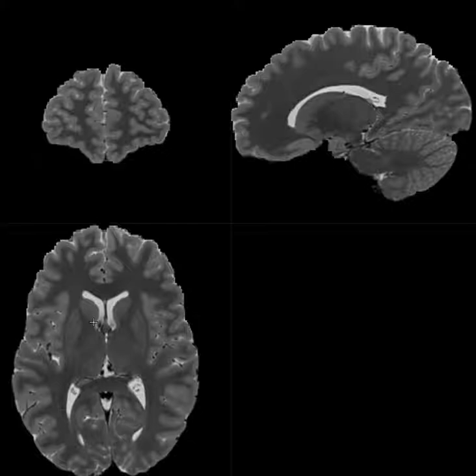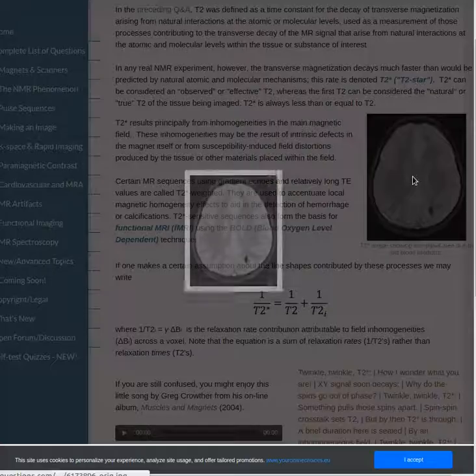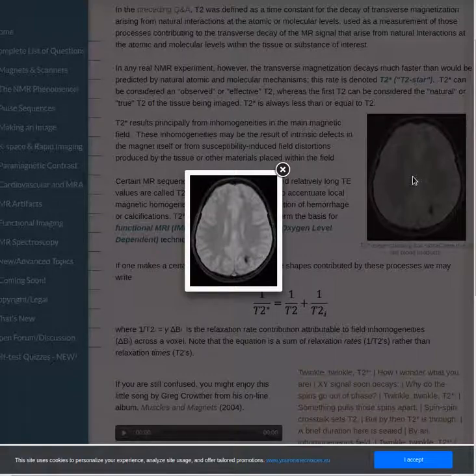So unfortunately, I don't have an example, or at least a 3D volume, of T2 star weighted images. But I'm going to go to a really good website called MRIquestions.com. And here we can see a T2 star weighted MRI. If you notice over here, the contrast in anatomy is probably even worse. We can distinguish the gray and white matter, but not as well as we would in T1 weighted imaging. But you can see this black bit over there, this decrease in signal.